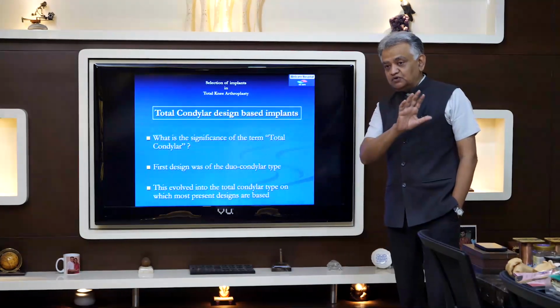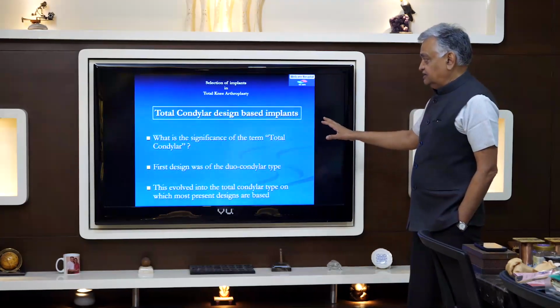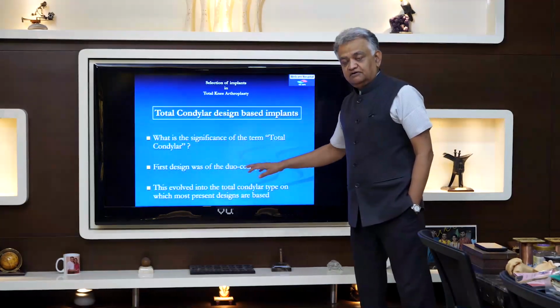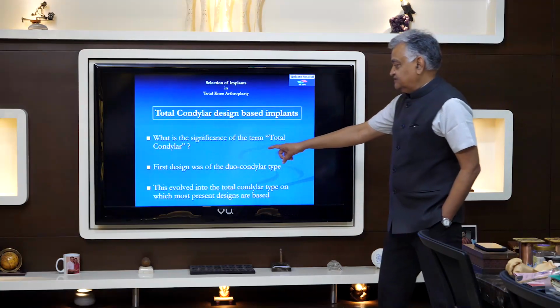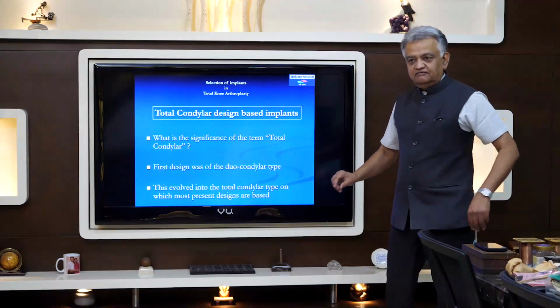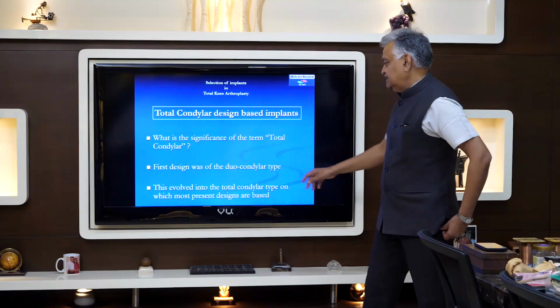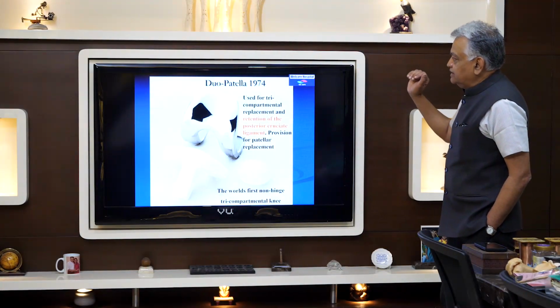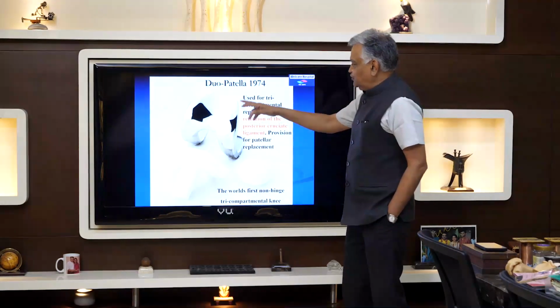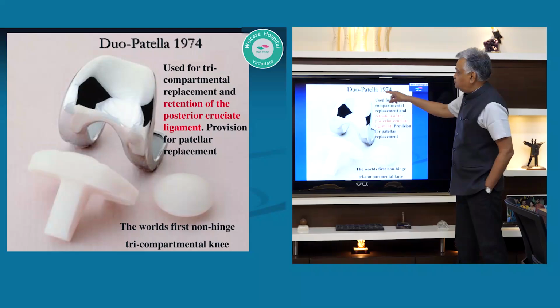And from then onwards, all the implants that you have ever seen are generally referred to as total condylar knees. So, as I said, the first design was duocondylar, where the patellofemoral joint was not taken into consideration, and this evolved into the total condylar. Next please. And before the word total condylar was brought into play, it was known as duopatella.